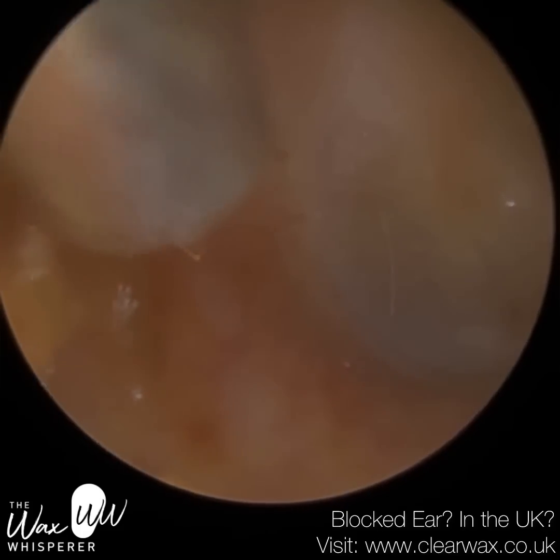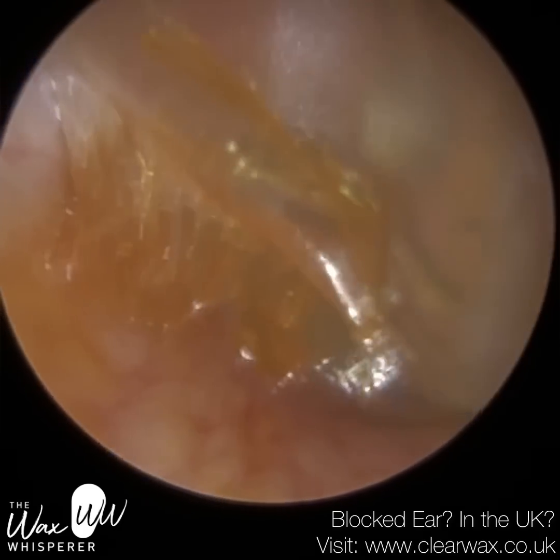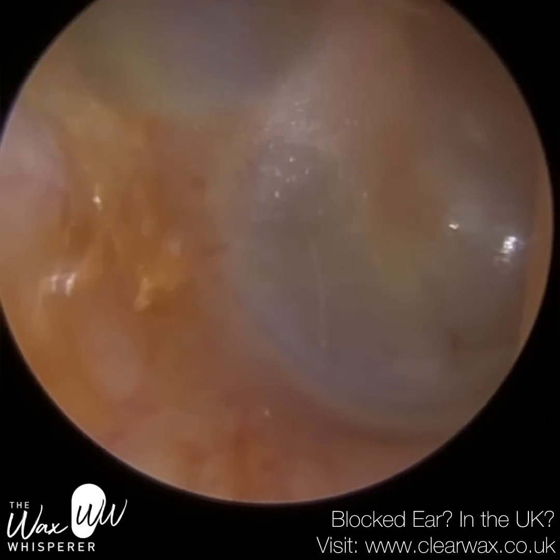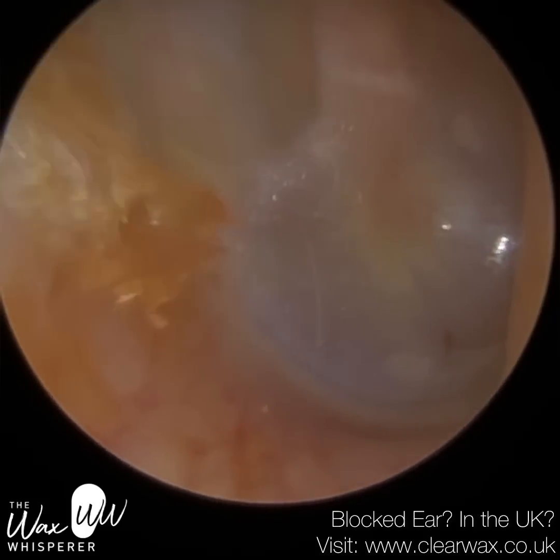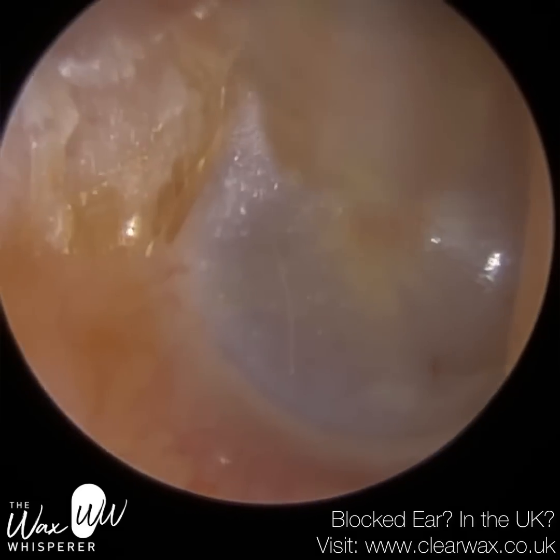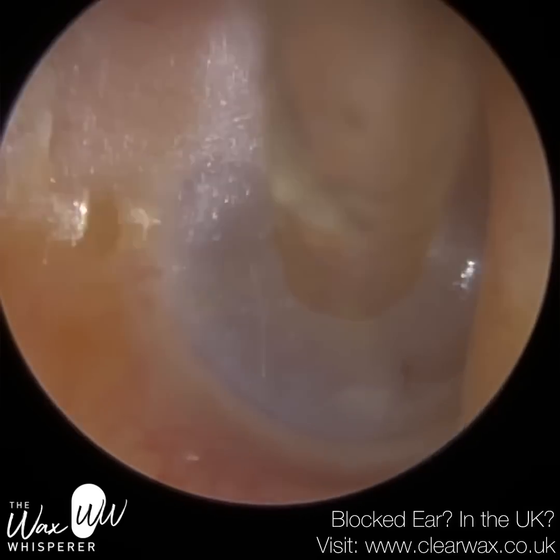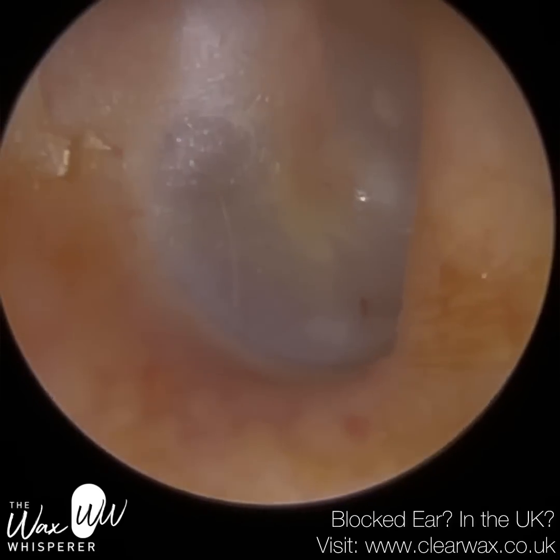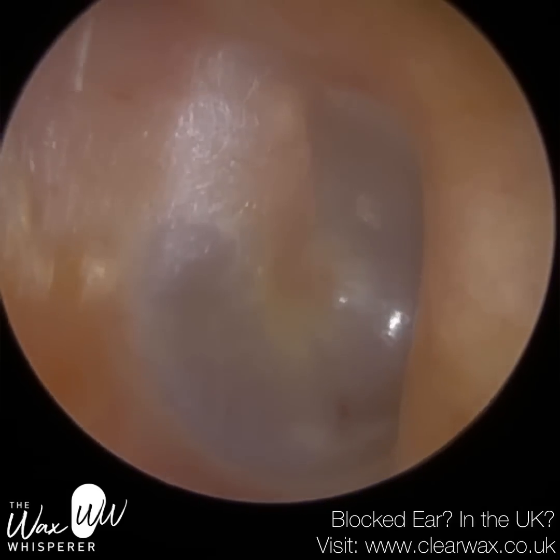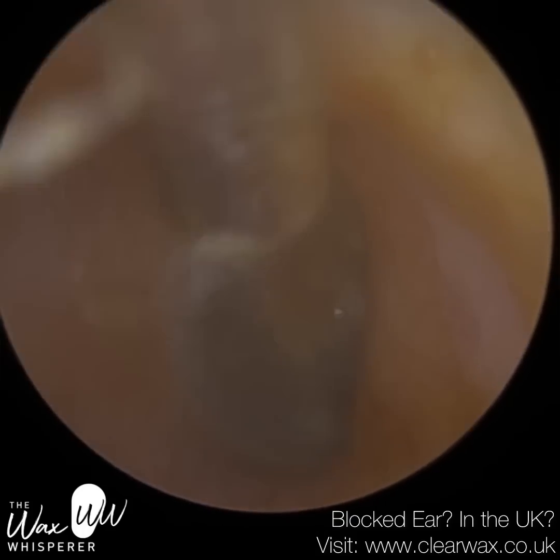So I would say the wax plug in this size, you saw as a big plug came out there, that was more of a type 3. So it came out in blobs. If it was a long singular piece, I would classify it as a type 4. I will upload the grading system. I don't have it at the moment, so I've modified the last one I did. I've provided some better images, but I will upload it in the next few days. So keep an eye out for that.